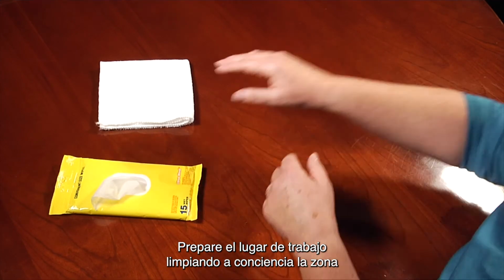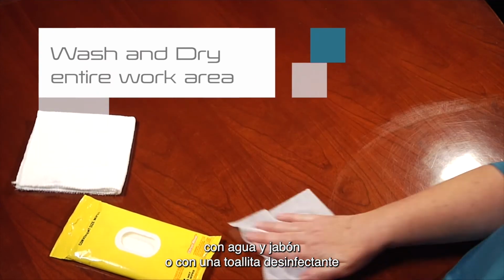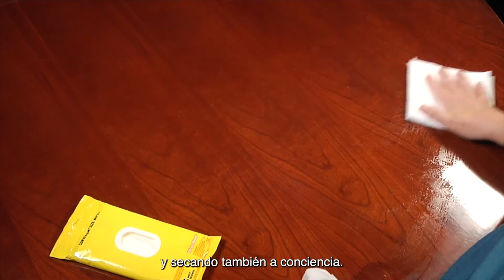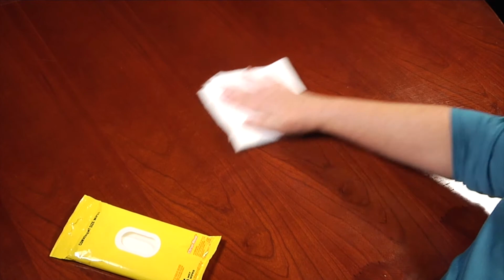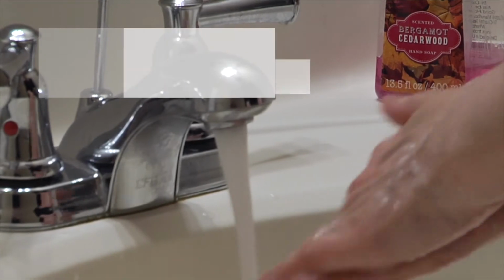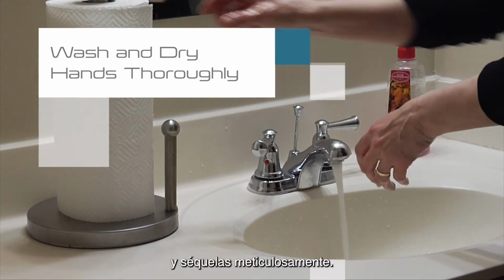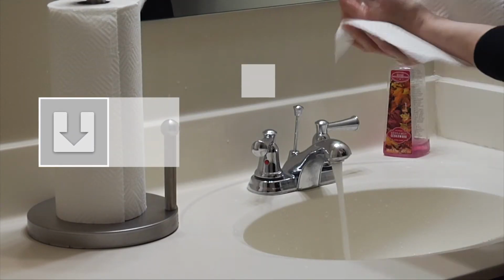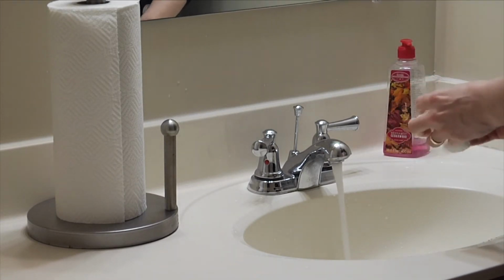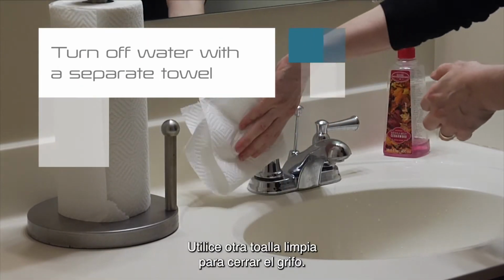Please begin by preparing your work surface by cleaning the area thoroughly with soap and water or a disinfectant wipe, and drying thoroughly as well. Wash your hands thoroughly for at least 20 seconds, and dry thoroughly as well. Use a separate towel to turn off the faucet.